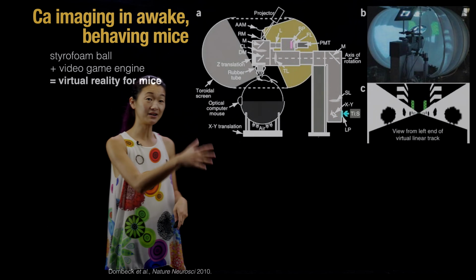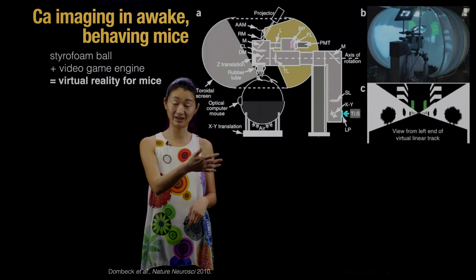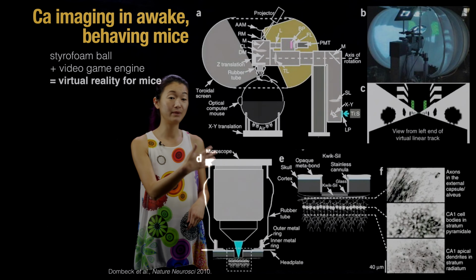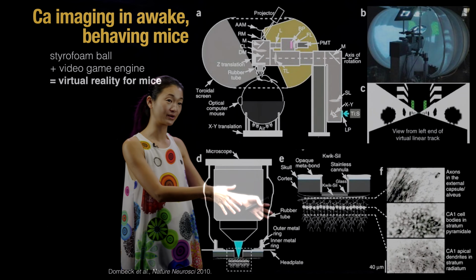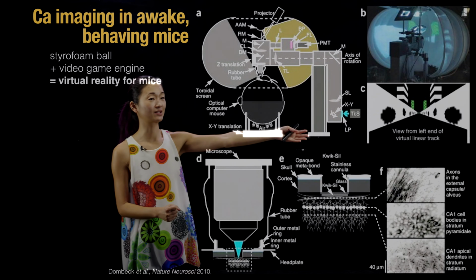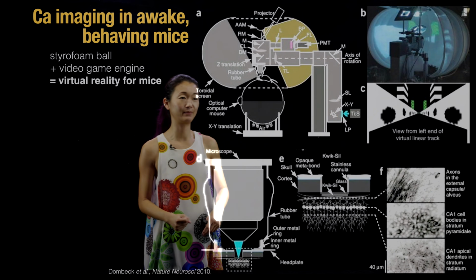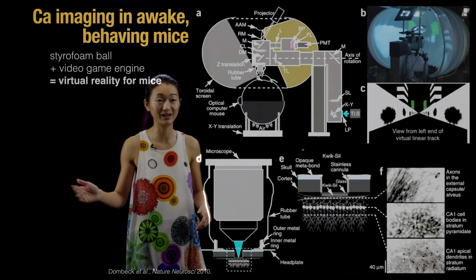And because this entire thing is underneath a microscope, and you have calcium indicators inside the mouse, you can measure the electrical activity, the neural activity of cells inside the brain as it's doing a navigational task like the following one. So that's the virtual reality system. That's a video game the mouse is playing. Maybe not the most, I mean, it's not Halo. It's not quite exciting. Like, you may not want to play this game.